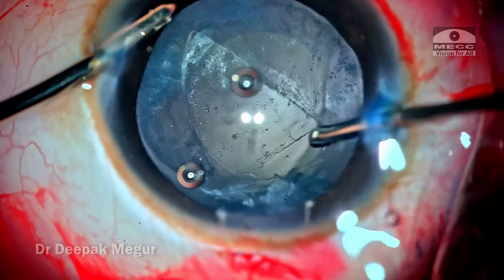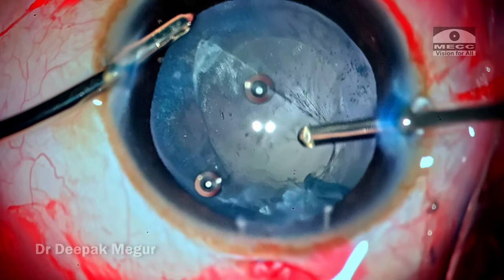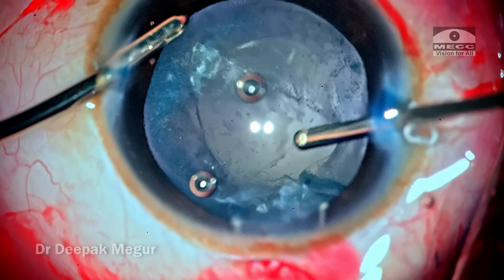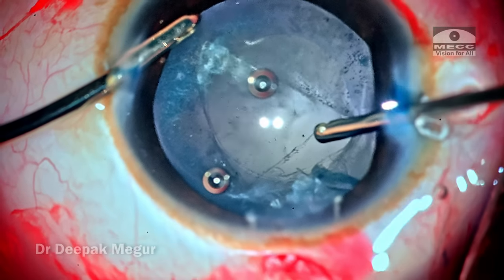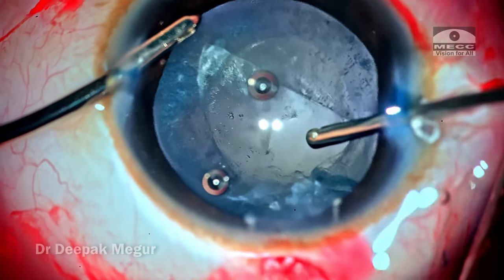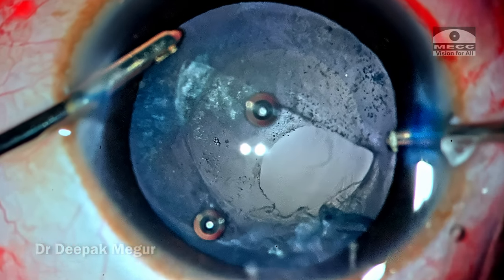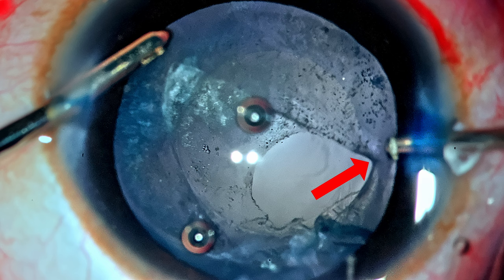I am now using the cutter to nibble at the thickened anterior hyaloid so that the visual axis becomes clear. There are a lot of inflammatory cells sticking onto this anterior hyaloid, and in a couple of minutes the entire visual axis is clear. At this point we can see that something is tugging at the posterior capsular tear.